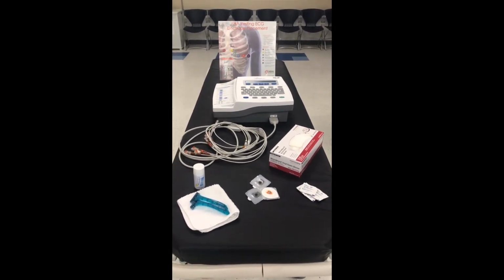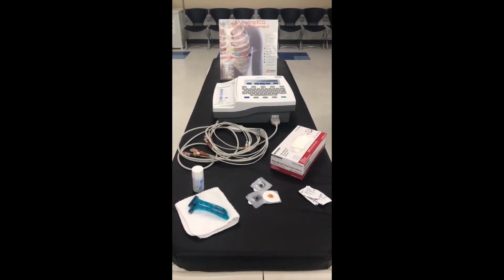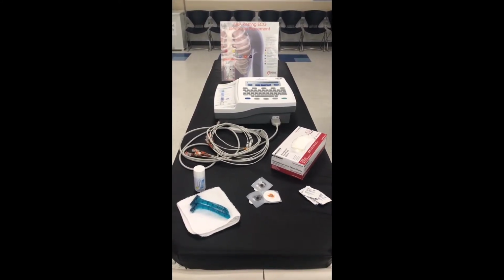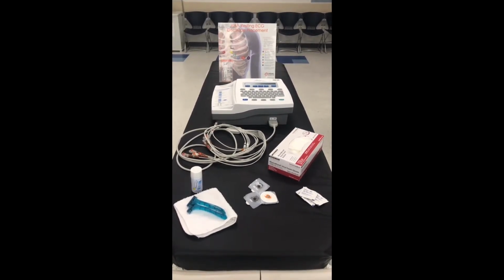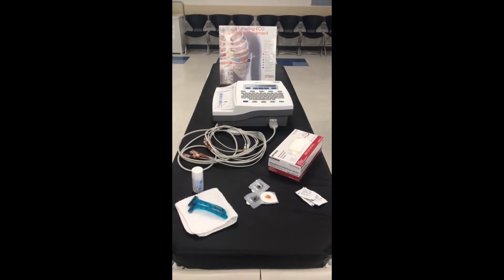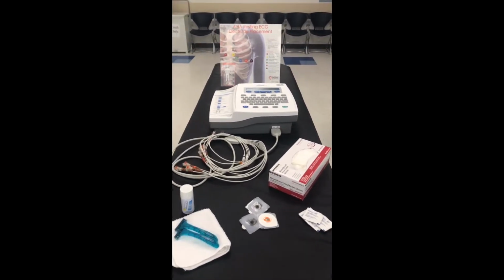So next we will be going over our supplies. You will need the following supplies: an ECG machine, some electrodes, leads, alcohol pads, gloves, and razors. This is the ECG machine.